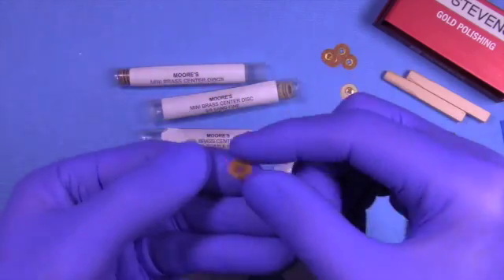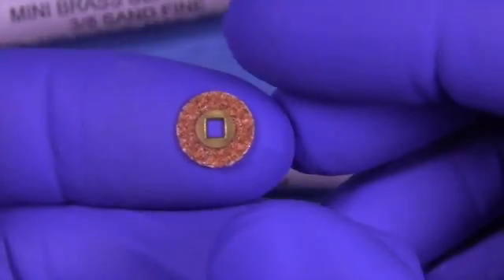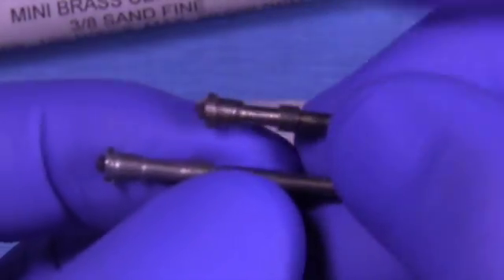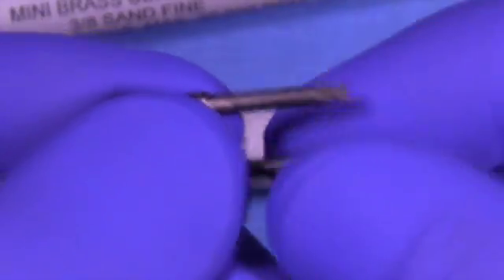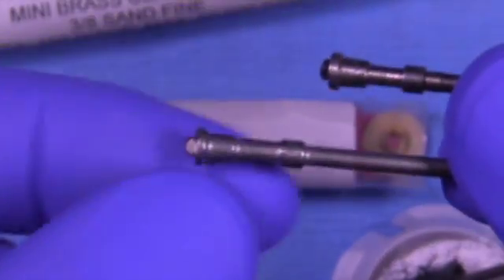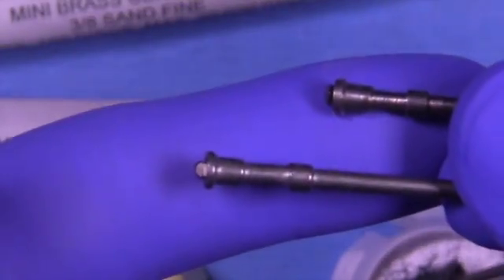Talk a little bit about our discs. These are the Moore's mini discs, only three-eighths of an inch. They have a little metal grommet in the middle. One side has the abrasive and the other side does not.